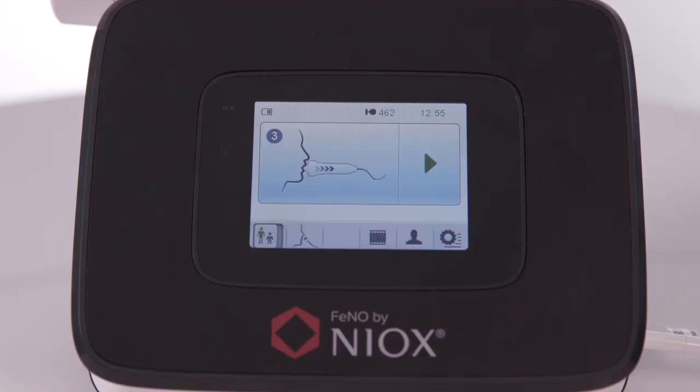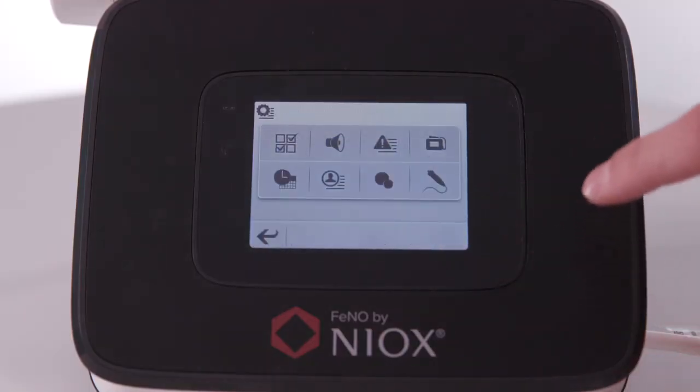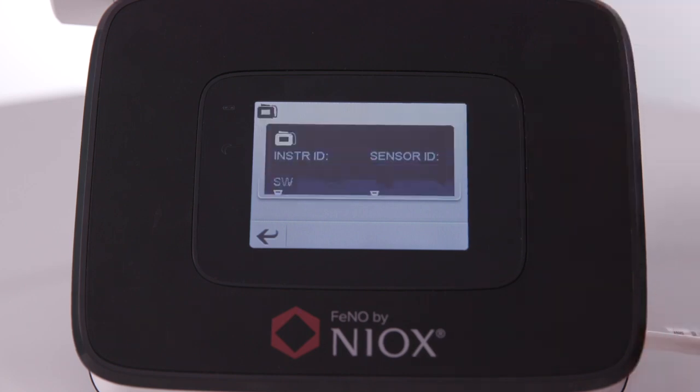Hi, I'm Michael from NIOX Customer Service. Today, I'm going to show you how to obtain device details on the NIOX VERO. First, select the settings icon in the bottom right, then the NIOX device icon in the top right.